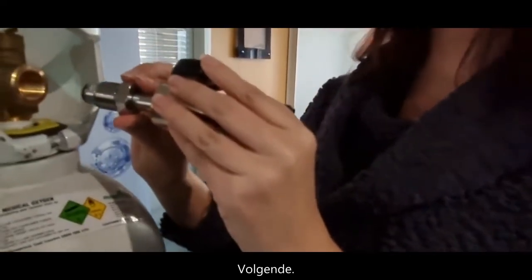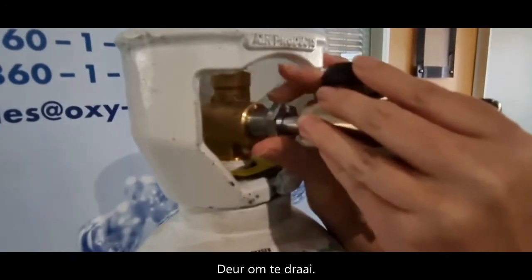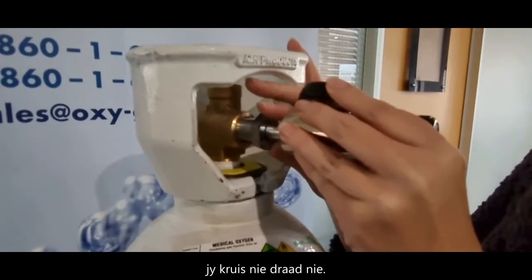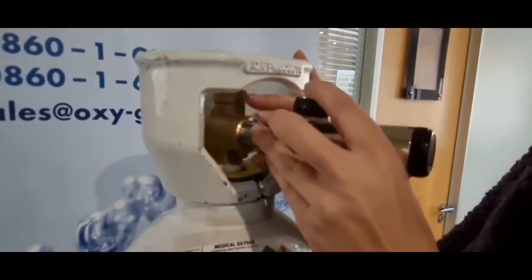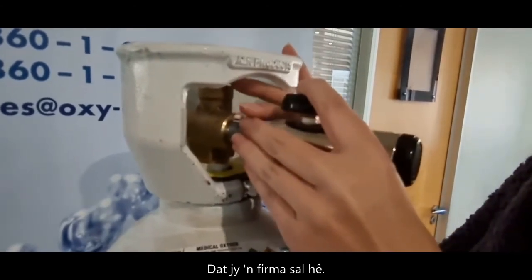Next, attach the regulator like this by turning clockwise. Make sure you do not cross-thread, and make sure that you have a firm fit.